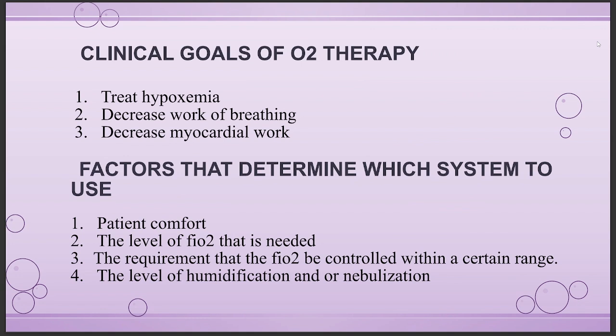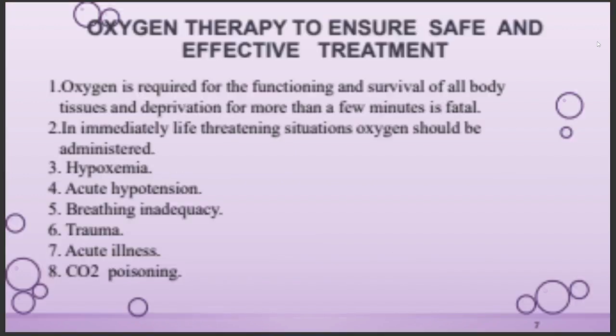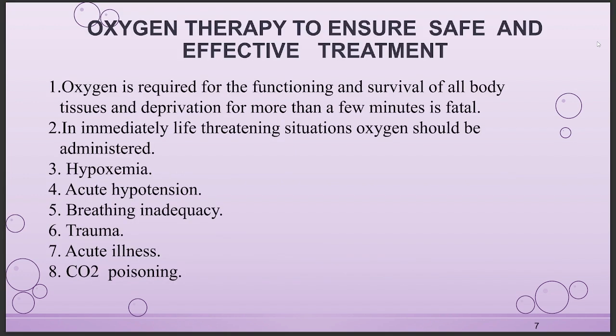Clinical goals of oxygen therapy are to treat hypoxemia, to decrease the work of breathing, to decrease myocardial work. Factors that determine which system to use are patient comfort, the level of FiO2 that is needed, the requirement that the FiO2 be controlled within a certain range, the level of humidification or nebulization, to ensure safe and effective treatment.